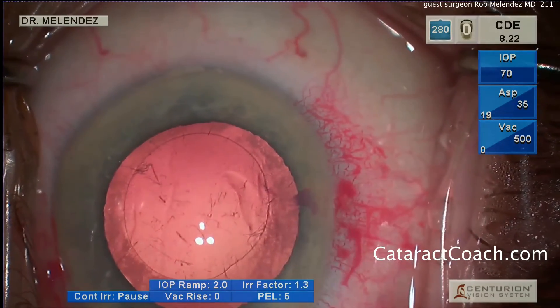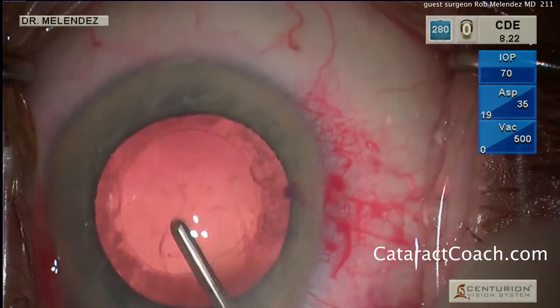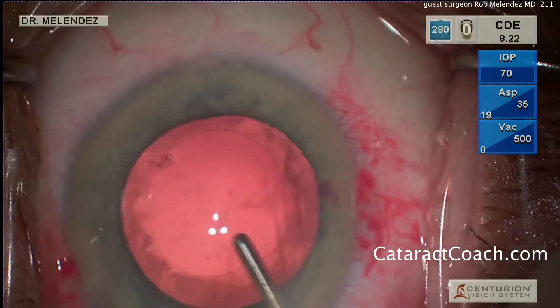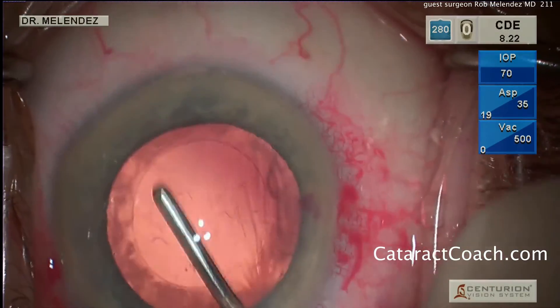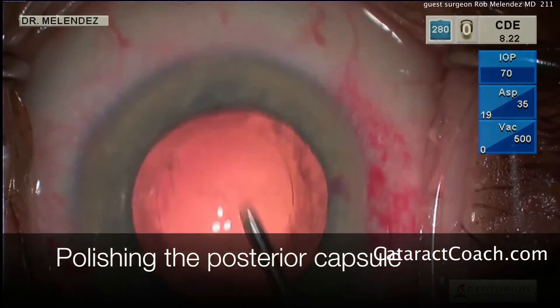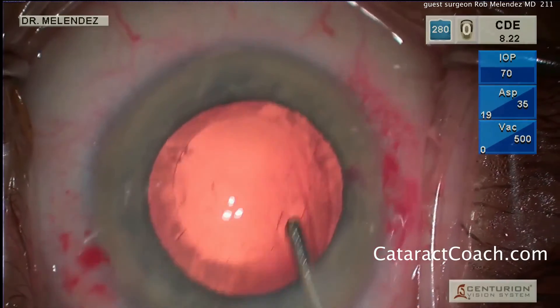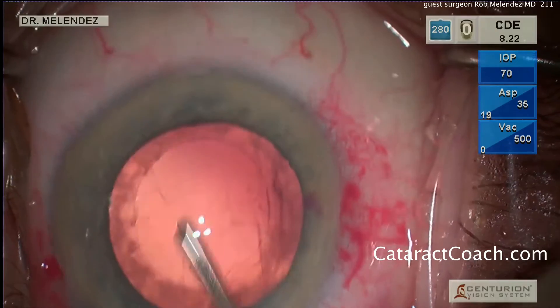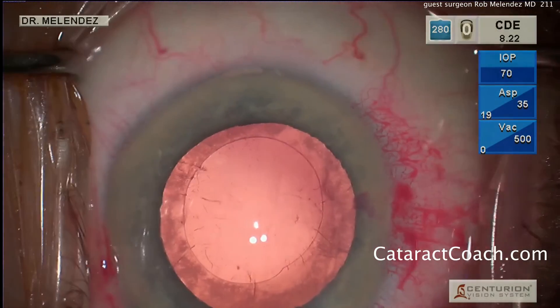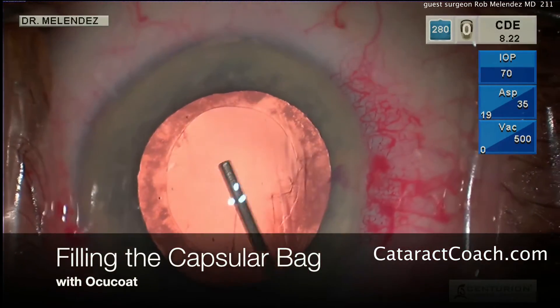At this point it's time to fill the capsular bag with viscoelastic — but actually, before he does that, he's doing a little capsule polishing. Nice and easy cleaning up and polishing of the capsule with just an aspiration device through the main incision. That's polishing of the posterior capsule, and it looks great. It's difficult to do this with just aspiration and no concurrent infusion — so this is not a technique for a novice.